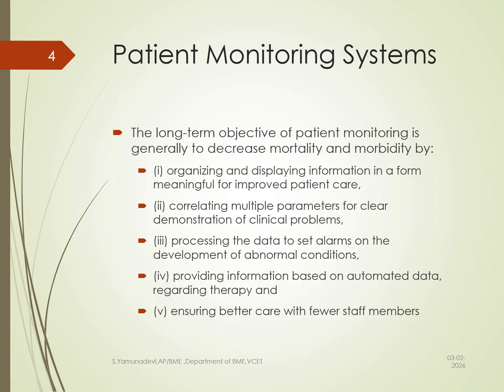This patient monitoring plays a vital role in providing organization and display of all the information, and also it correlates the patient problems with a multi-parameter monitor, and it sets data alarms which are used to indicate the abnormal conditions of the patients. It also provides automated data for therapy planning, and it ensures better care and reduces the staff required for handling ICU patients.